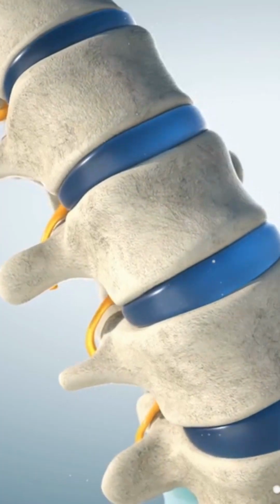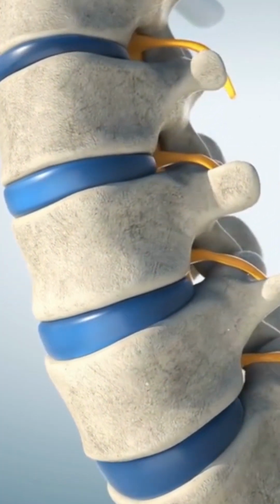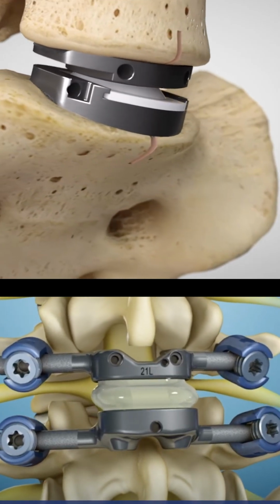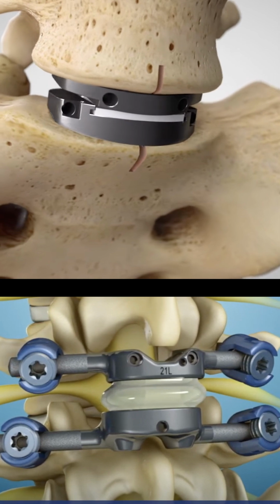One of the newest frontiers in spine surgery has been the option of motion preservation as opposed to a fusion. As you know, each spinal motion segment is a shock-absorbing disc in the front and facet joints in the back. And one of the things I'm very excited about, and Dr. Ament, my partner, has truly pioneered this, is to be able to do a 360 motion preserving operation.